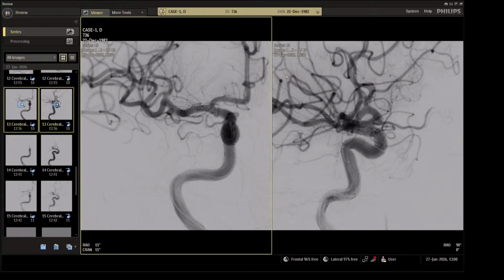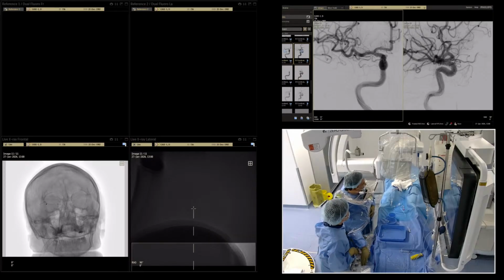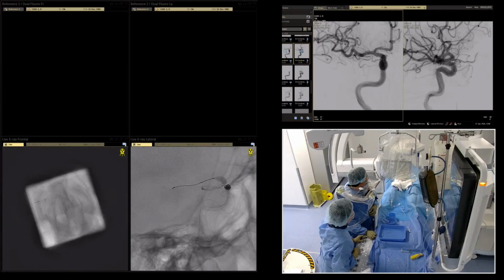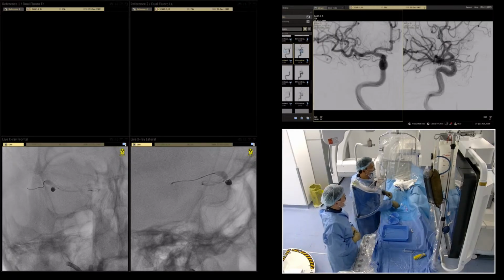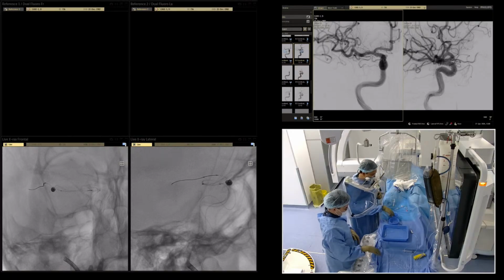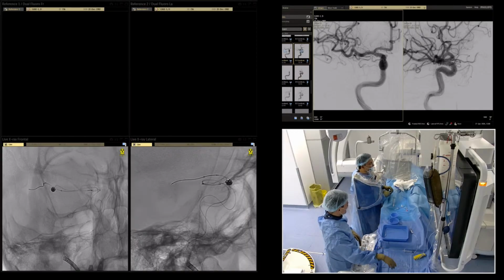As the side branch is still functional, that's why it might be bleeding, no? Okay. Yes, now everything is moved. The balloon went forward. Okay, let's see. I will pull a little bit the balloon. Yes, the microcatheter with the coil is inside the aneurysm.